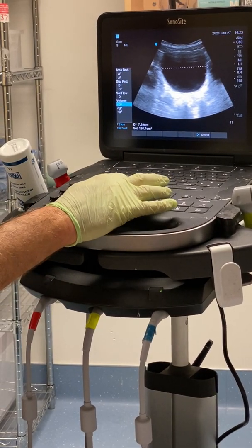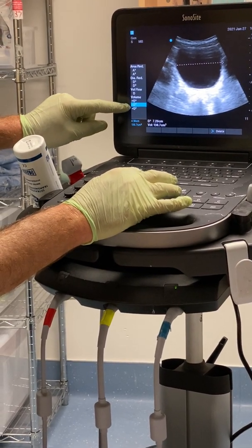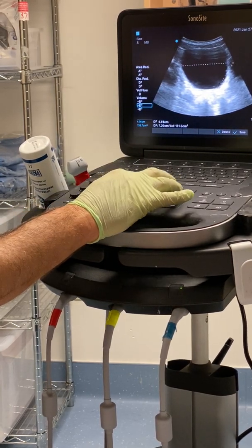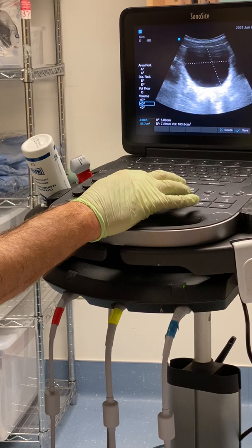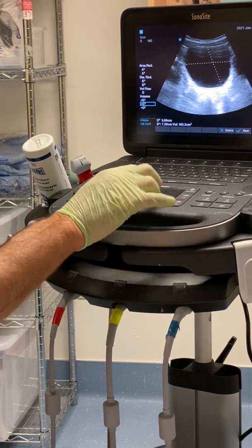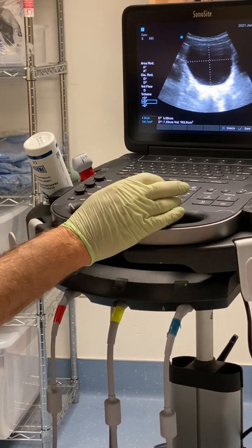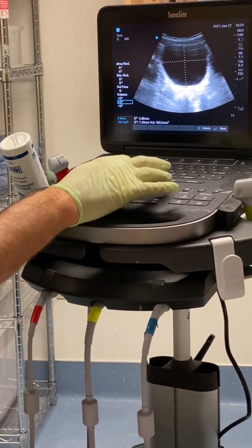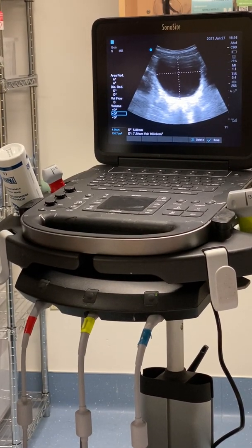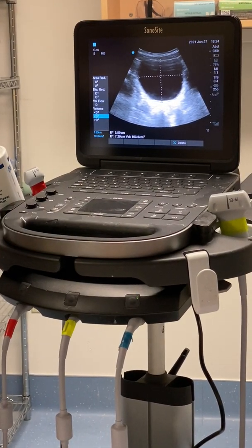Take your trackpad and move the cursor down to D2. Push calipers again to get a second caliper. Measure from the top of the bladder — closest to the abdomen — to the deepest part of the bladder. Push select, move the second cursor down to the deepest part of the bladder. Save that with save calc — that's your second dimension.